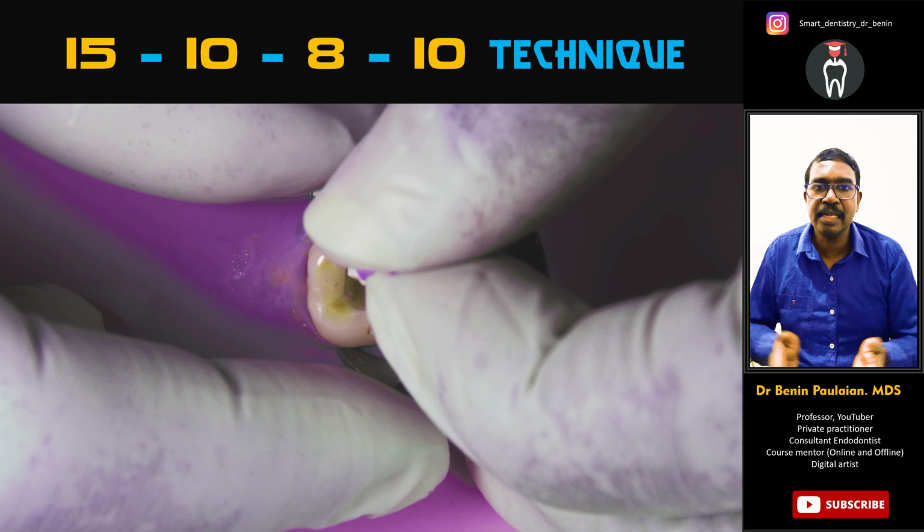So now I just created a smooth pathway with a 10 size file, and after that you can put files in all the canals, maybe a 10 size file in all the 4 canals that we have negotiated, and then you can go for a working length radiograph.